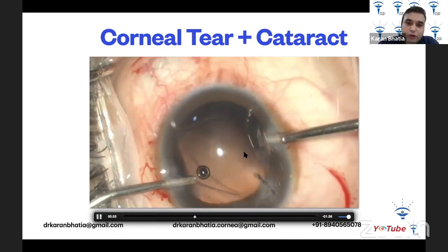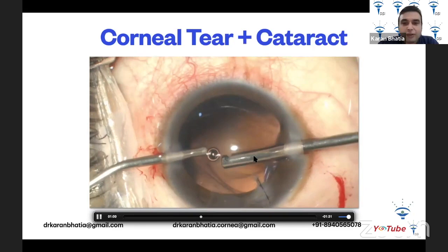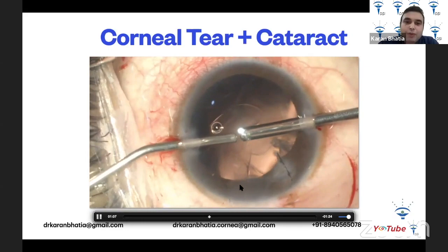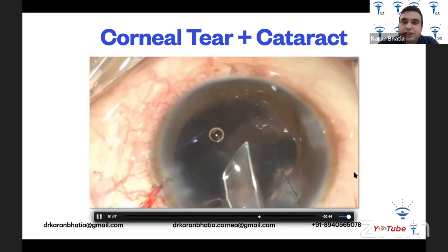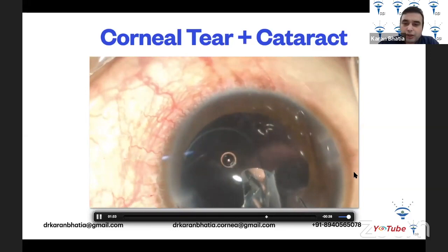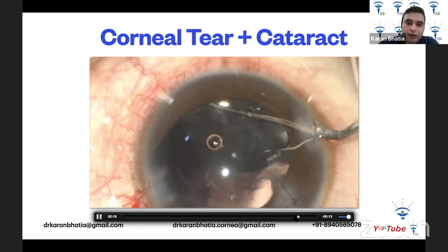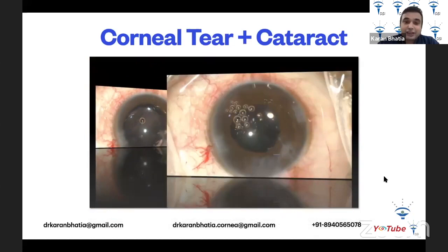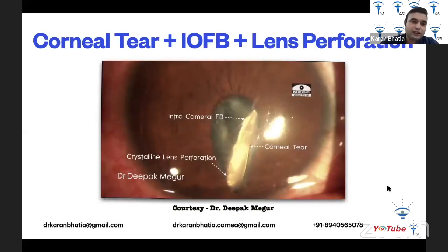After discovering the posterior capsular breach, inject OVD or HPMC or viscoelastic from one side to push the vitreous down. Use a vitrectomy cutter to do the vitrectomy while tamponading so the vitreous doesn't come forward. Once vitrectomy is complete with no vitreous in the anterior chamber, a three-piece foldable intraocular lens can be easily implanted into the sulcus. This patient did very well.